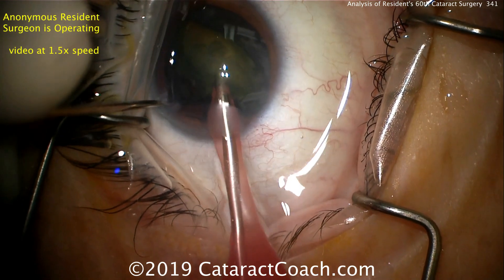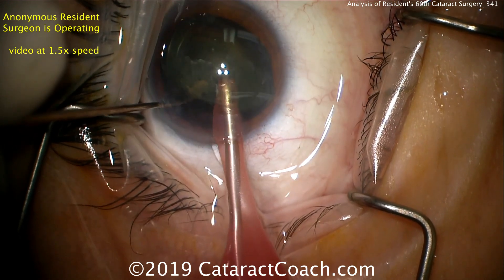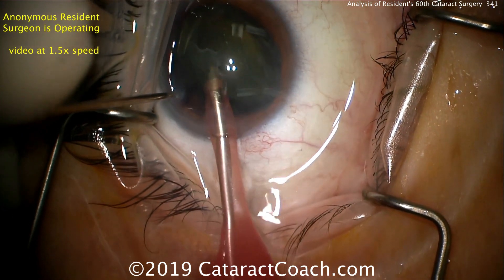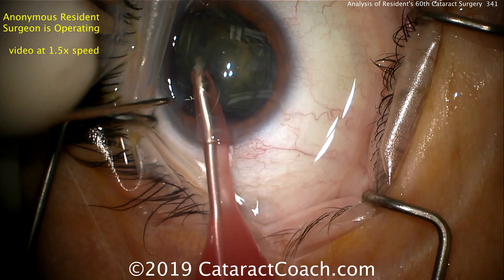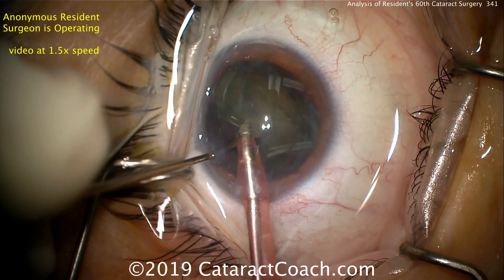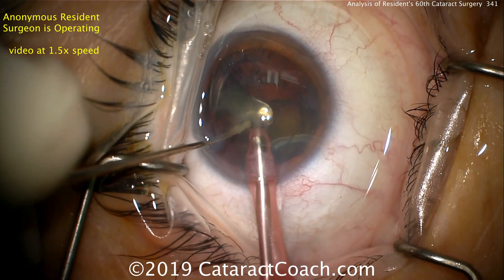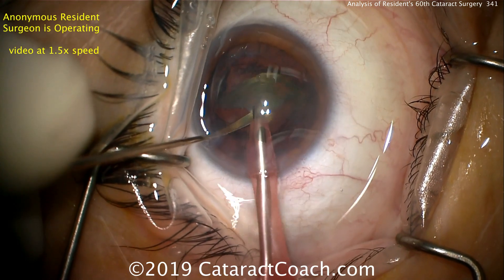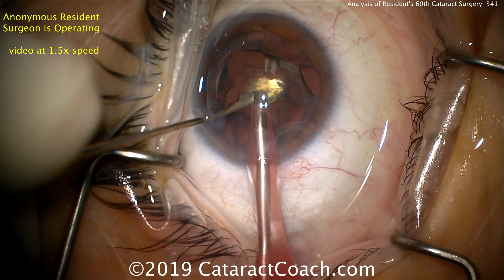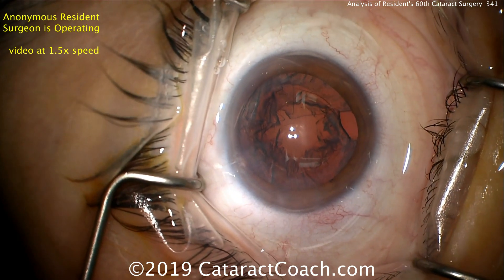The nucleus technique looks like it's going to be the tilt and tumble technique popularized by Dr. Lindstrom. There's not going to be any division of the nucleus — just using the phaco probe to eat away at the nucleus. It's been tilted out of the capsular bag and now tumbled, meaning pushed towards the probe, so there is no nucleofracture technique done here. For a softer lens like this — perhaps 2+ nuclear sclerosis — this is a very good technique. The goal is to keep the phaco tip occluded with lens material, apply a mild degree of phaco energy, and use vacuum and fluidics to wolf down the cataract pieces. I'd encourage the resident, though, to learn a good nucleofracture technique. Stop and chop or a variation of phaco chop is important because when you have a denser nucleus, tilt and tumble is not ideal. But for a soft lens like this, it works beautifully.